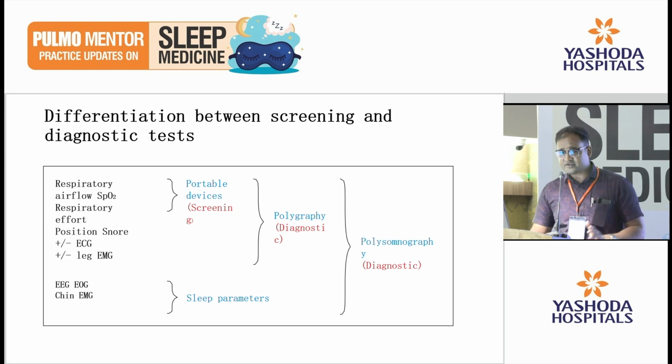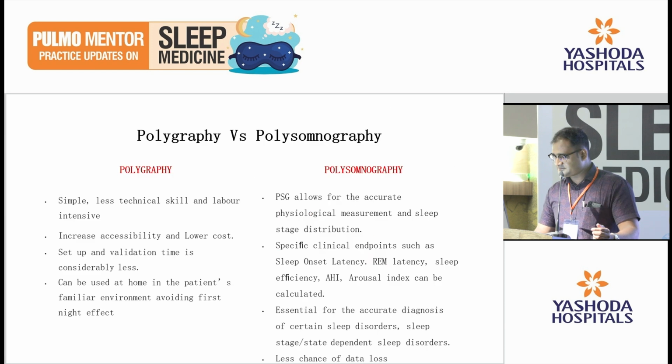In polygraphy, you are not detecting the sleep stages, but in polysomnography, you are detecting the sleep stages. And the detection of sleep stages is also very vital from the monitoring point of view and the titration point of view. That will be dealt with in the subsequent lectures.